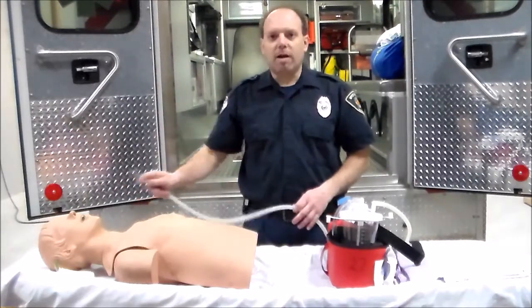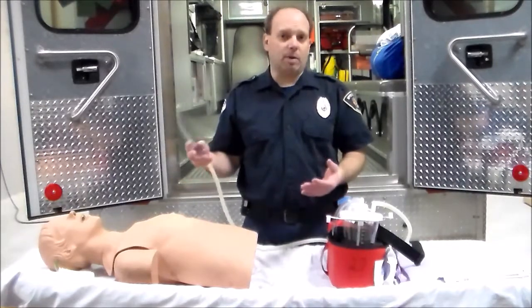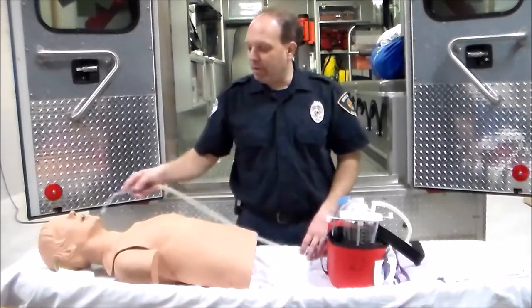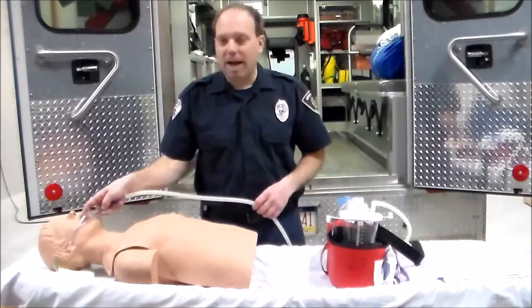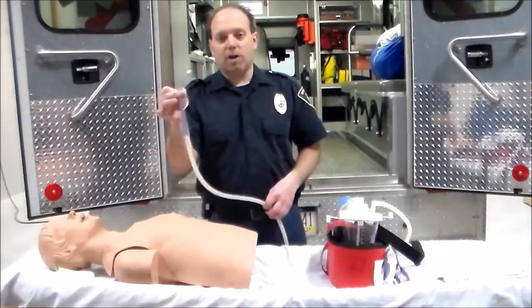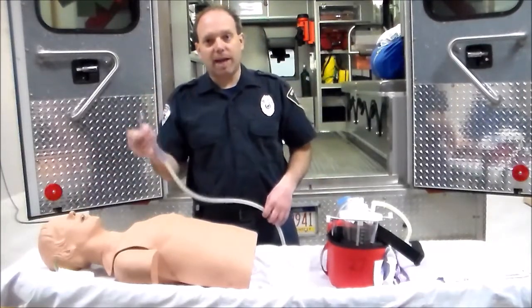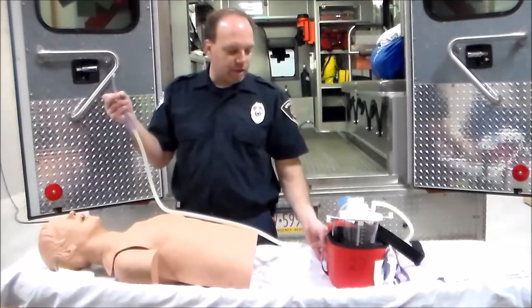When we go to suction our patient, one thing we want to make sure of is that we do not stimulate the gag reflex if there's already been a problem. So we measure from the tragus of the ear over to the mouth, and you can block that off to mark how far the suction catheter will go. We will then turn on our suction unit.